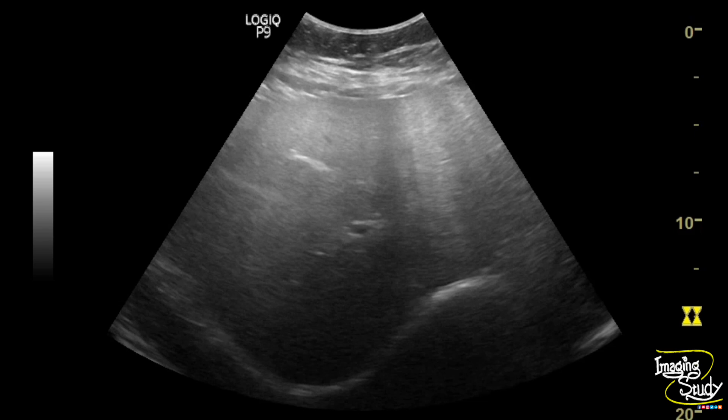Here's the picture. You can see the proximal part looks brighter than the distal part, with well visualization of the intrahepatic vessels and diaphragm.